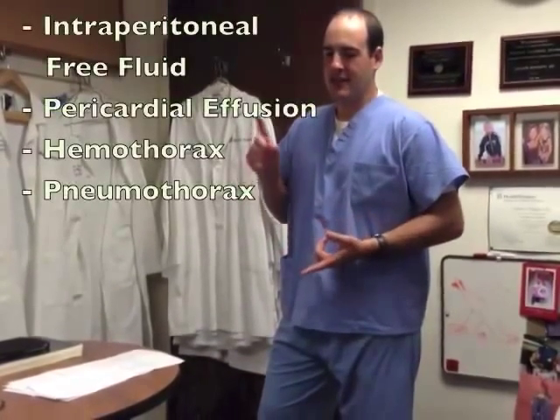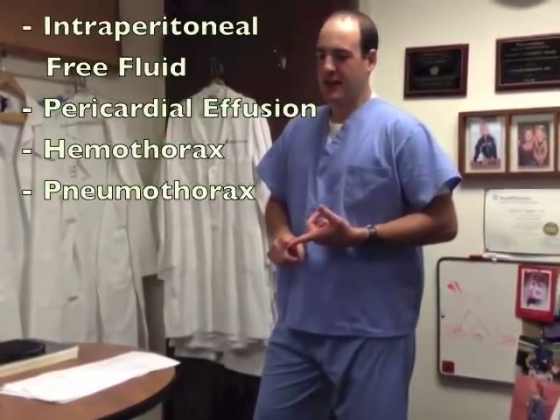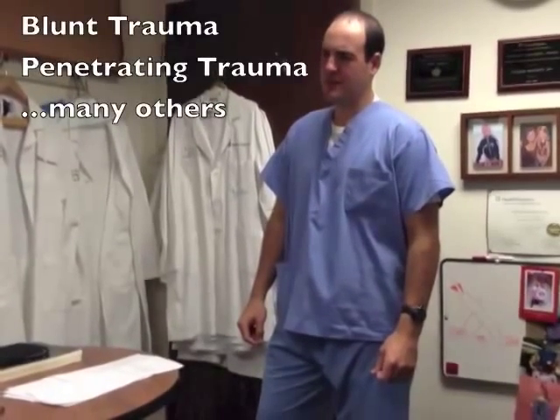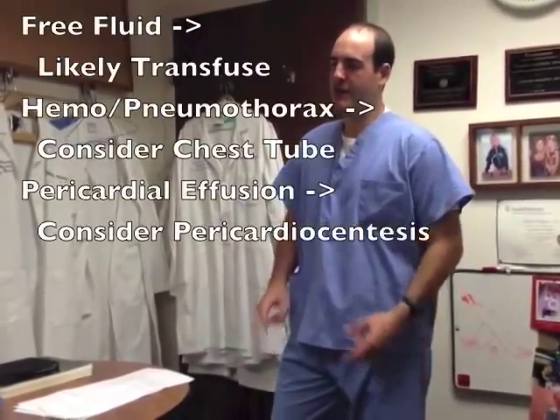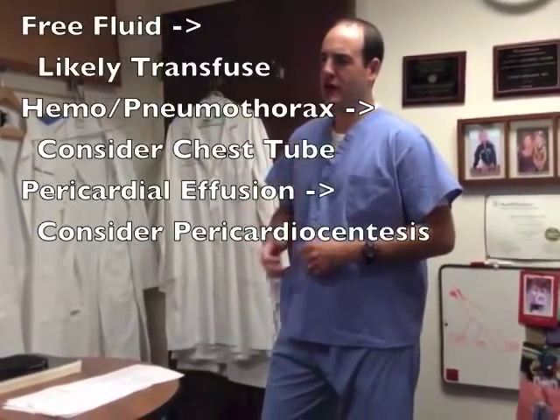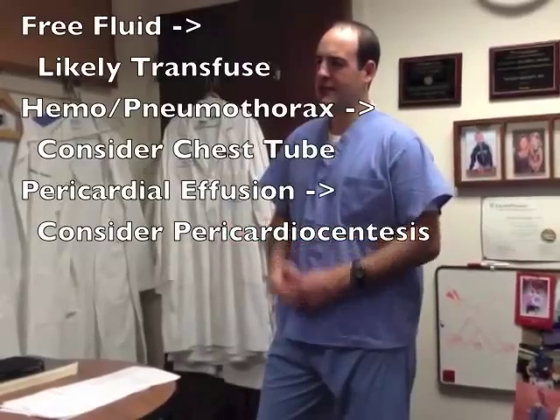Ultrasound is aimed at answering focused questions. What 4 questions does the eFAST answer? From what I remember reading, it answers questions like, is there intraperitoneal free fluid? Is there pericardial effusion? Is there hemothorax or possibly pneumothorax? And what are the indications for it? Any blunt or penetrating trauma. And when's it most useful? I think it's most useful in hemodynamically unstable patients because it'll help guide your treatment, whether you need rapid fluid or blood resuscitation, or possibly a quick intervention like a chest tube or needle thoracostomy, or even possibly a pericardiocentesis.